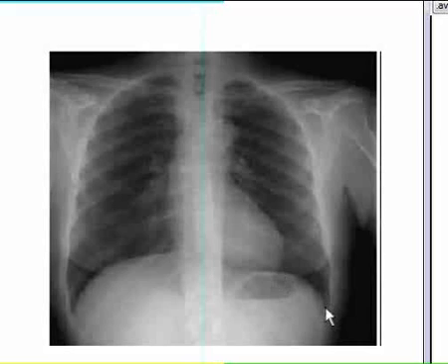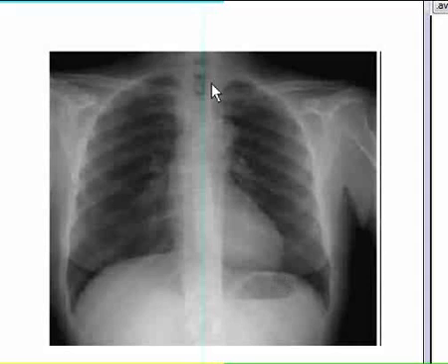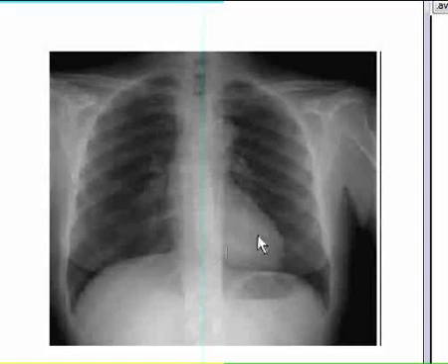This is the left costophrenic angle. Mediastinum, including the heart, is here.